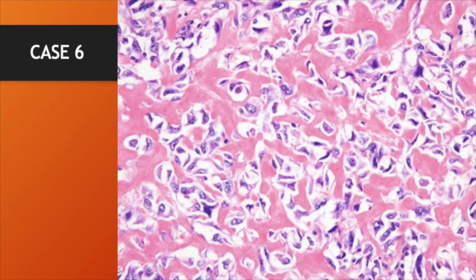Well, we don't have fibrous tissue in a storiform pattern, so we can rule that one out right off the bat. We don't have obvious host trabecular bone with fibrous tissue in between the trabeculae, so we can throw that one out. So now we're into the osteoid production.